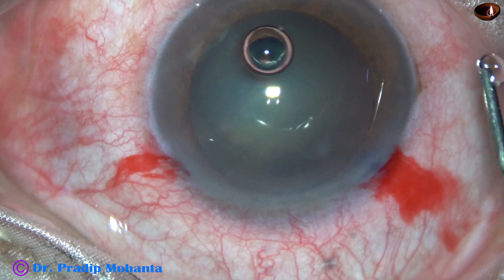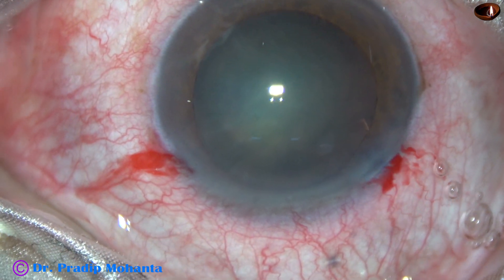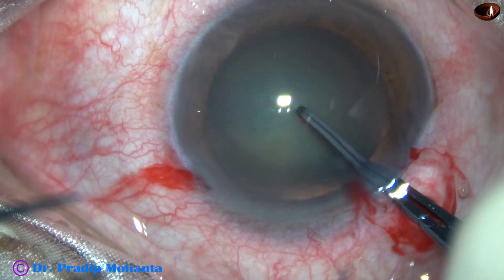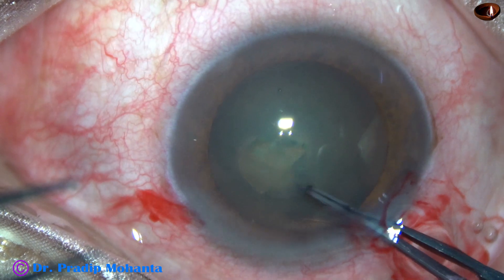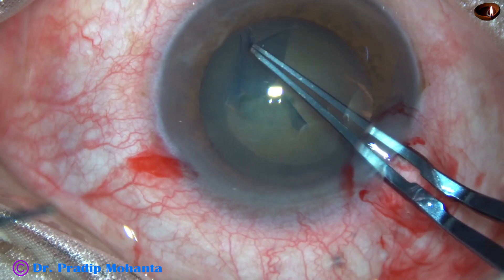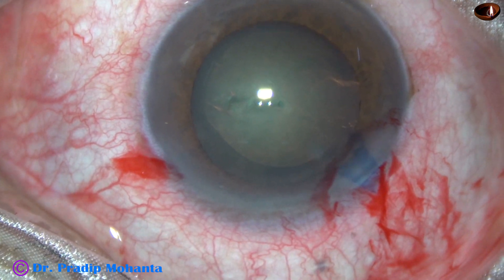2% hydroxypropylmethylcellulose is used to fill up the anterior chamber. Now we are going to do capsulorhexis. The anterior capsule is torn at the center with the tip of the hydra forceps. The capsular tag is raised and guided anticlockwise all around to get an adequate size rhexis of about 5 mm.